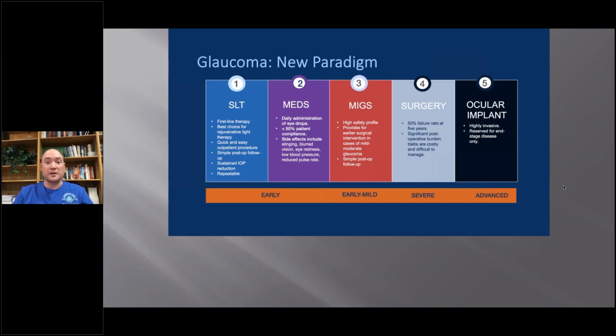They are the glaucoma specialists, and they're seeing the advanced severe cases when they're on 2, 3, 4 drops. They need surgeries. When you look at data that says who's initiating the first glaucoma treatment, it's optometry a good chunk of the time, certainly the majority of the time. So in my personal opinion, this is not Lumenis's opinion, but I'm just speaking as Nate Lighthizer, this is ideal for optometry. When you look at the data, to me, it's a public service that optometry should be able to do SLT first line because it's equivalent to first line.